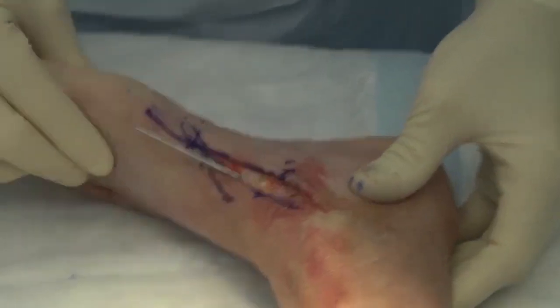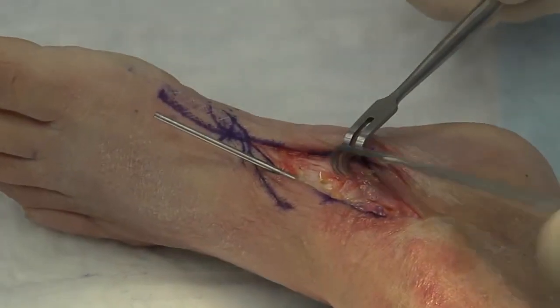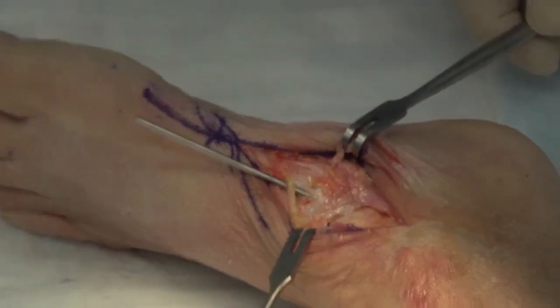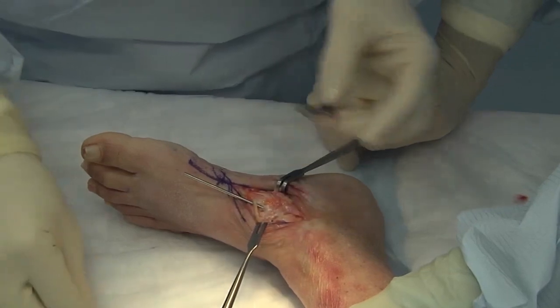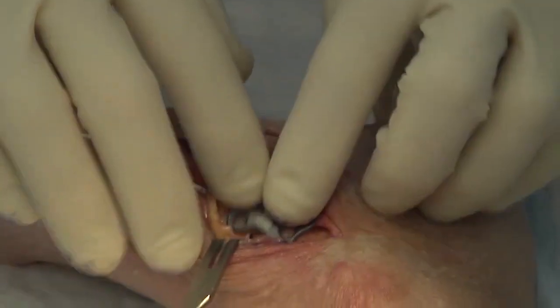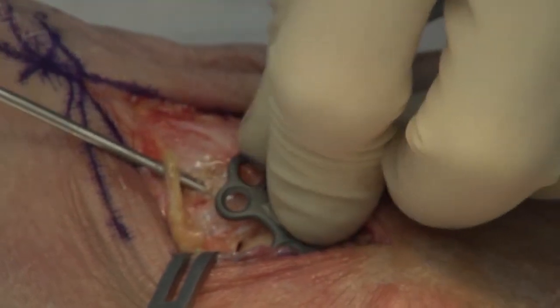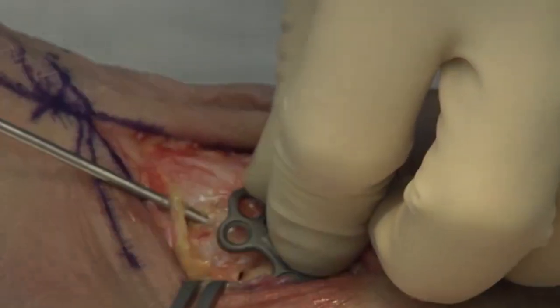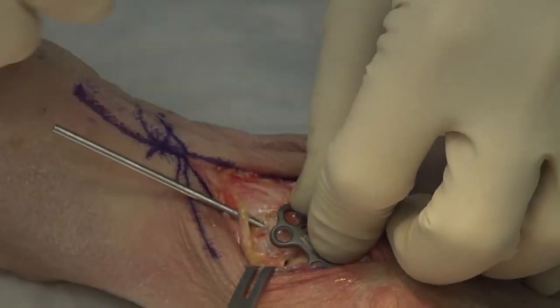Now you can see that joint is no longer mobile. The Variax II system has two different size plates, and these plates are designed to fit the contour of the talonavicular joint — a short plate and a long plate depending on the size of the foot, which is a judgment you will make intraoperatively. The plate is designed to fit on the medial side, which is the biomechanically advantaged design to allow this plate to act as an I-beam to resist the deforming forces, which are going to be from plantar to dorsal.